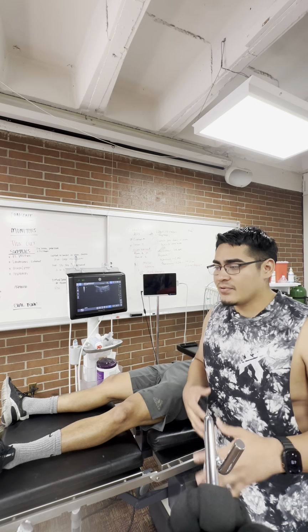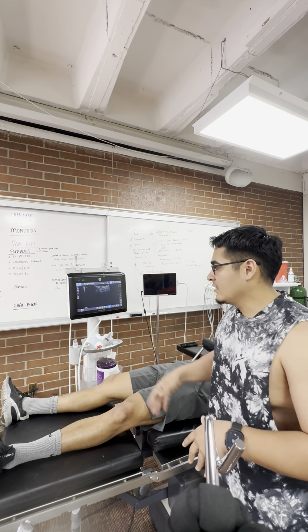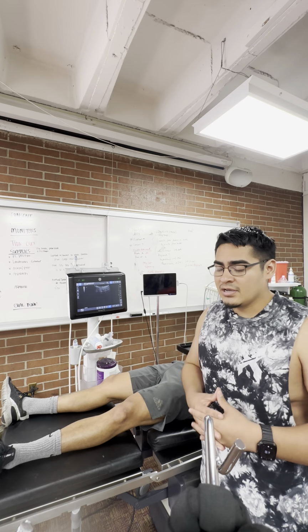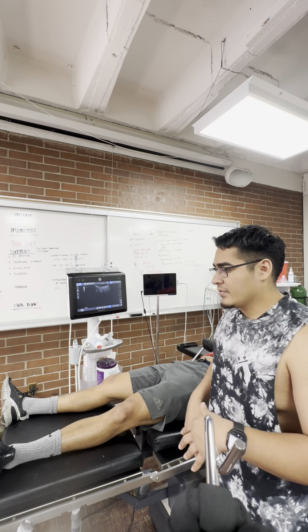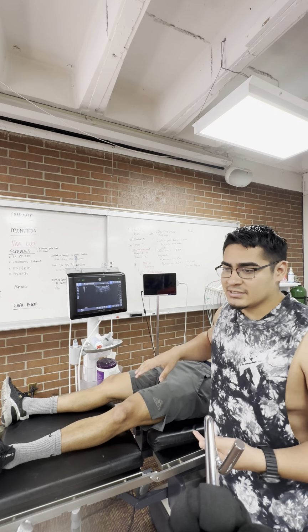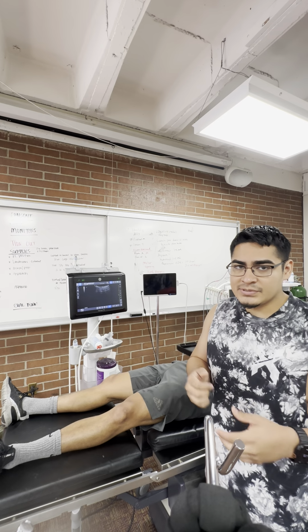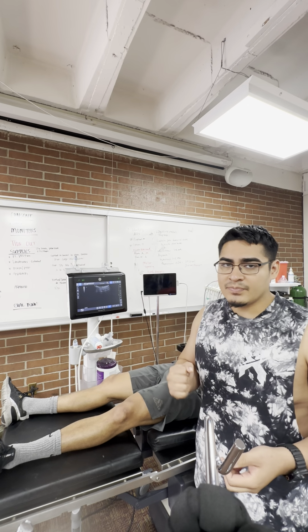And so after that, we would gather all of our equipment, including ultrasound with ultrasound cover, Stimulex needle with the nerve stimulator, all of our PPE. We would get the appropriate cleaning supplies, the proper draping supplies, proper probes that we're going to be using. We're going to be using a curved probe for the PENG block and a linear probe for the left IJ visualization.